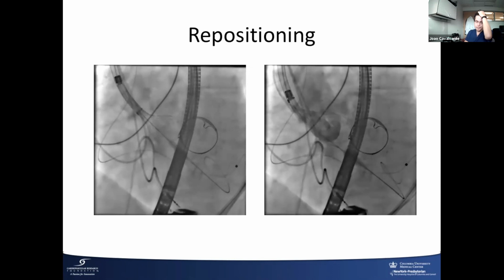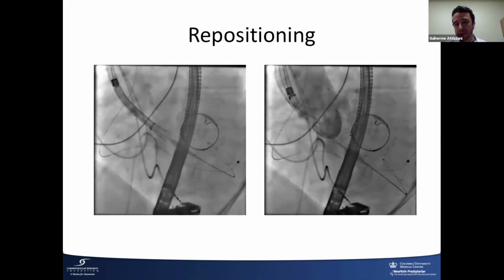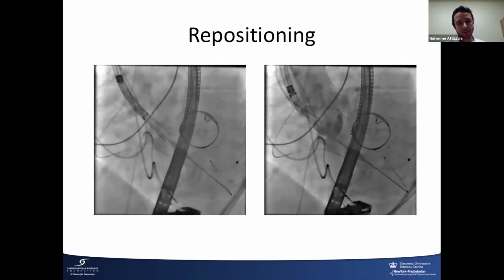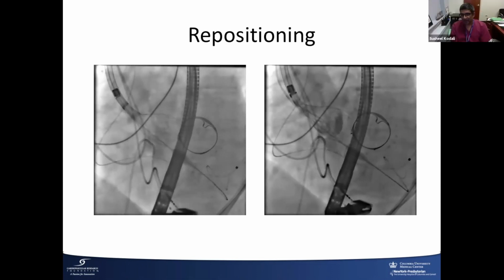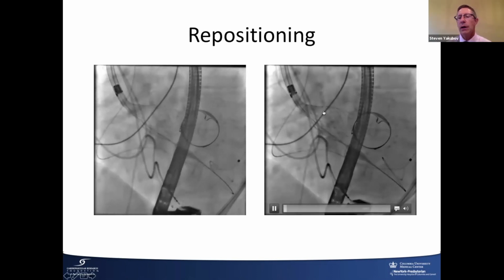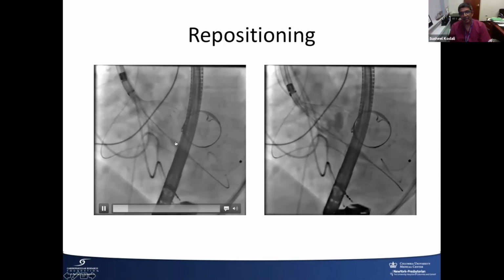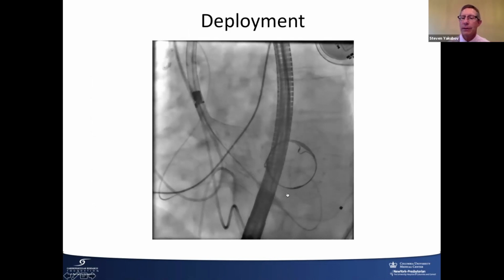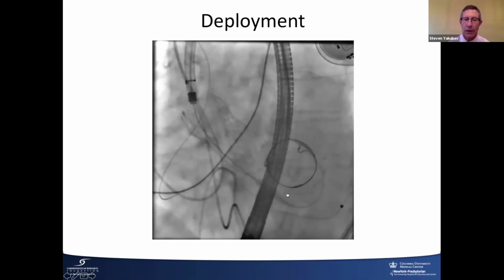Yeah. I think, in that position, maximizing oversizing, I would doubt that he would have an aortic embolization. But again, I think it's a great insight. I think it's sort of more risk benefit, as Steve said. My thought was, listen, I just want to get my fiddle there. If you look at this position and then the next before deployment, you see how it pulled and this side dropped and this side came up. Yep. And when you do this, you're rapid pacing on deployment, right, Sushil? I think that's really helpful for AI, to pace to stop the heart.